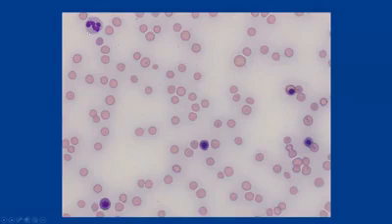The other thing I'm seeing is a segmented neutrophil up here. There may be a faint Dohle body on the edge of this cell, but this isn't looking too toxic right now. And cats can have small numbers of Dohle bodies, and we're not going to make grand diagnoses from just a single cell. I don't see any platelets in this film area, so that corroborates the thrombocytopenia, or fits with what we had already said.